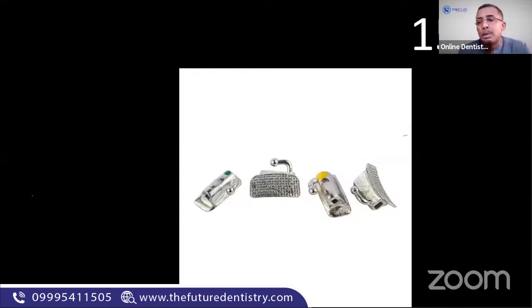Okay, now question number 15, somebody wants to give a try. What is this? Molar tube. Perfect. Now, molar tube, no, bracket, no. Reshma, it's not bracket, it's molar tube. Perfect. But in molar tube, the question can be confusing here, wherein it can be called as a bondable molar tube or a weldable molar tube.